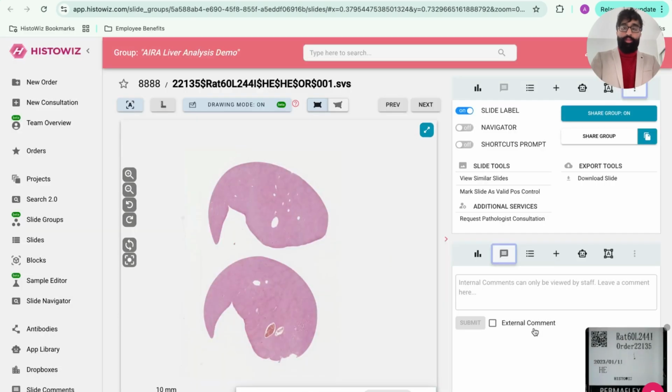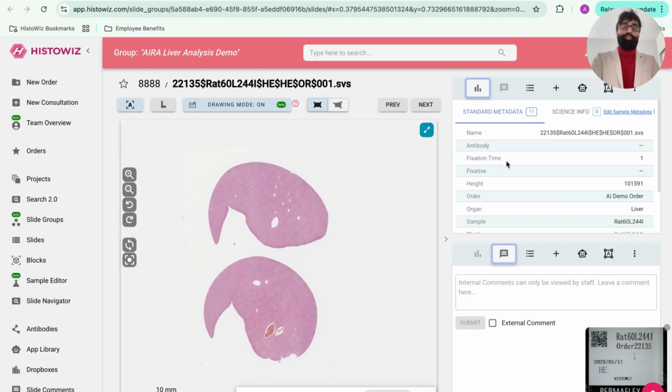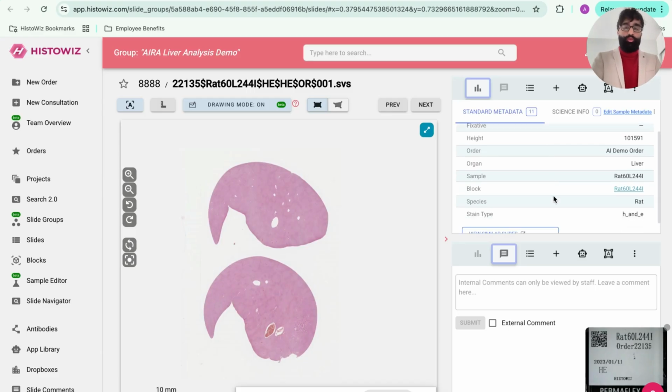Now, for every image, we have some critical information that you can see. One is the metadata, which I spoke about when I was talking about how you can search the metadata and modify it. So you can view the metadata for every single image. And what's interesting is that you can also look for which tissue block that slide came from. Again, this is not relevant if you have uploaded slides directly to the platform. And again, I won't go into detail about this feature, but HistoWiz has a block management solution that gives you visibility as to what tissue block it came from if you digitize slides with HistoWiz.